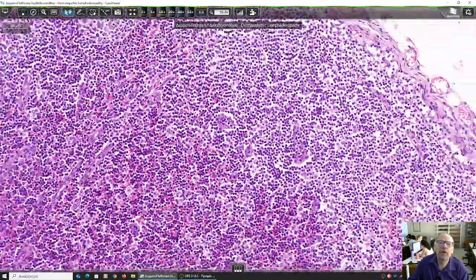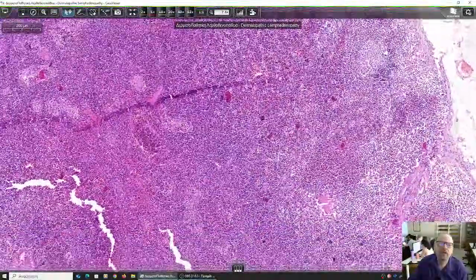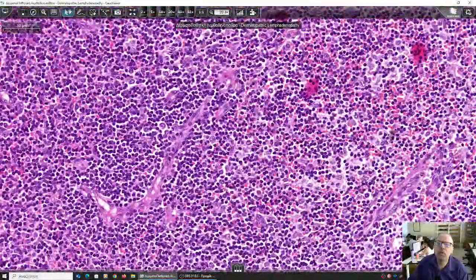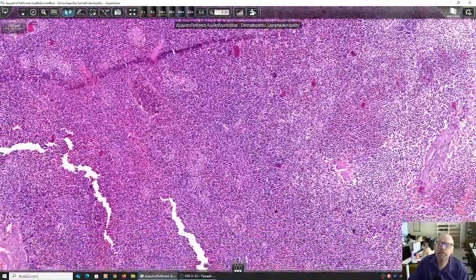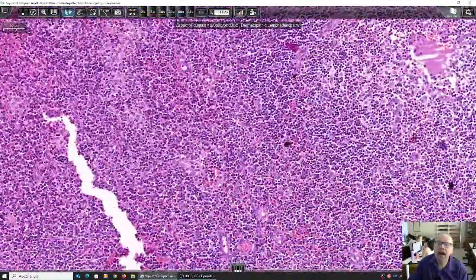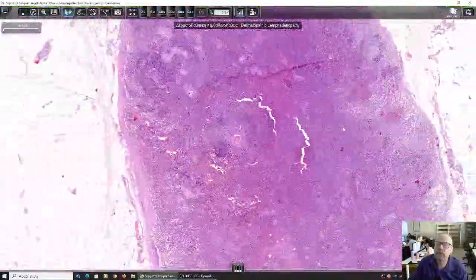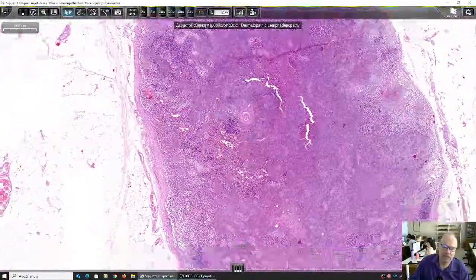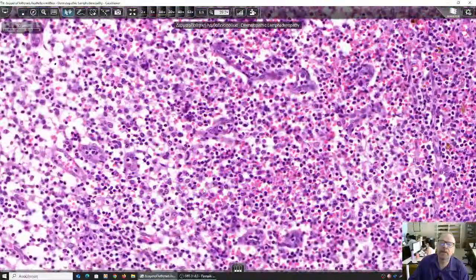So, what are these cells? And let's have a look, what do they phagocytose? Because in some places, we might see pigment similar to the one that we saw in the melanocytic lesions that we have studied.